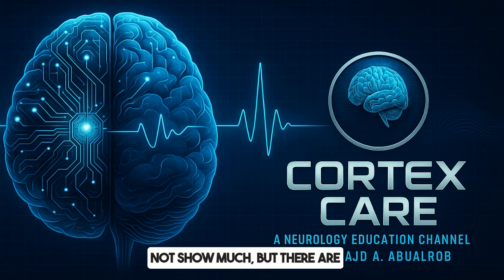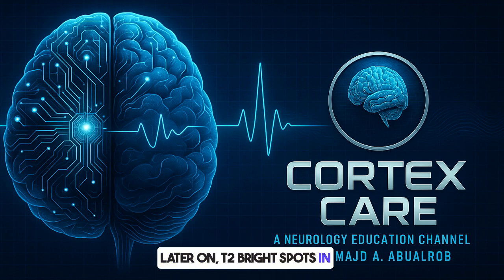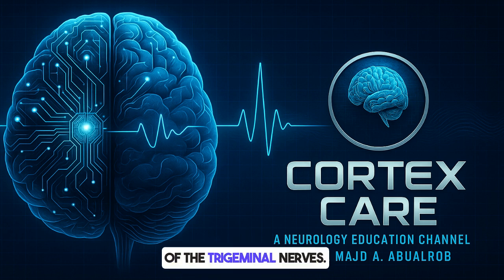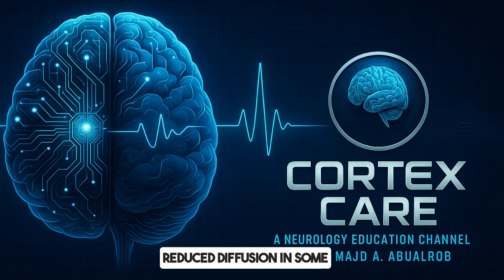But there are increasing case reports describing various abnormalities. It's a growing list. Like what kind of things? Things like leptomeningeal inflammation, atypical inflammatory lesions with brainstem or hippocampal atrophy later on, T2 bright spots in the hypothalamus, hippocampal swelling, also symmetric T2 hyperintensities in the cerebellum, its connections, peduncles, and the brainstem that sometimes improve with treatment. And interestingly, some cases show bilateral swelling and brightness of the trigeminal nerves. Yeah, the ones for facial sensation and chewing. Seeing that in a patient with suggestive symptoms like bulbar problems might be a diagnostic clue. Reduced diffusion in some areas has also been reported.